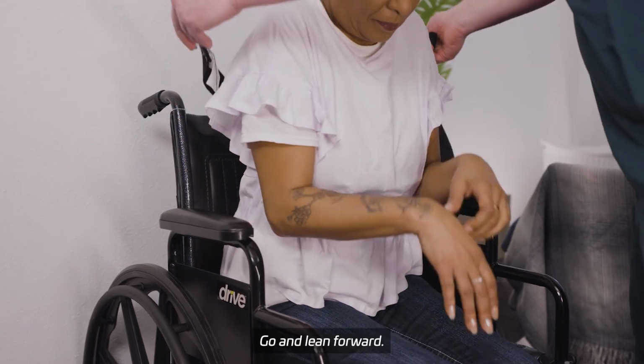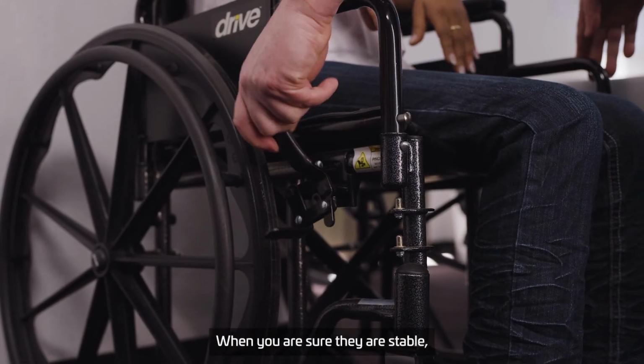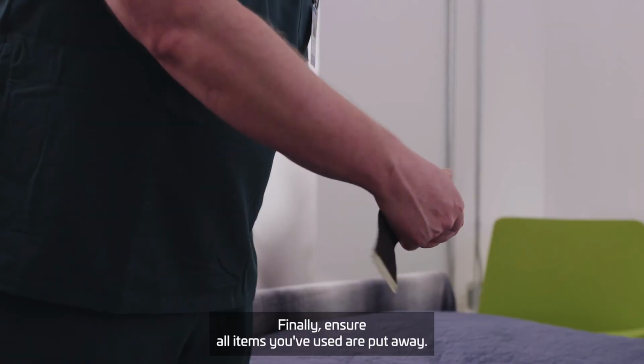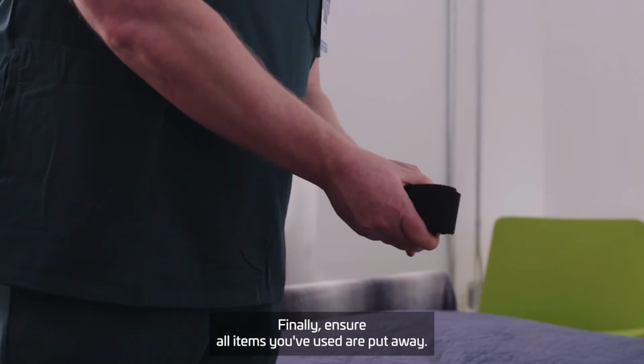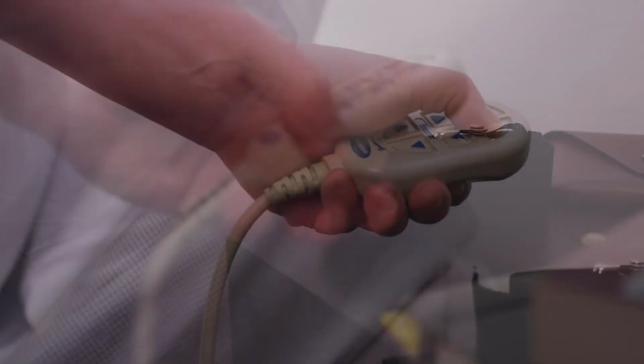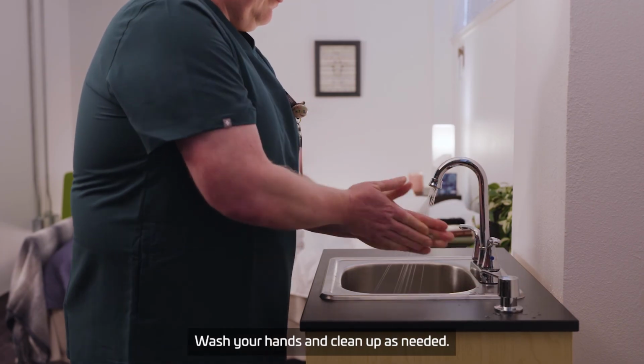All right, go ahead and lean forward. When you are sure they are stable, help them as needed with any assistive devices. Finally, ensure all items you've used are put away. Wash your hands and clean up as needed.